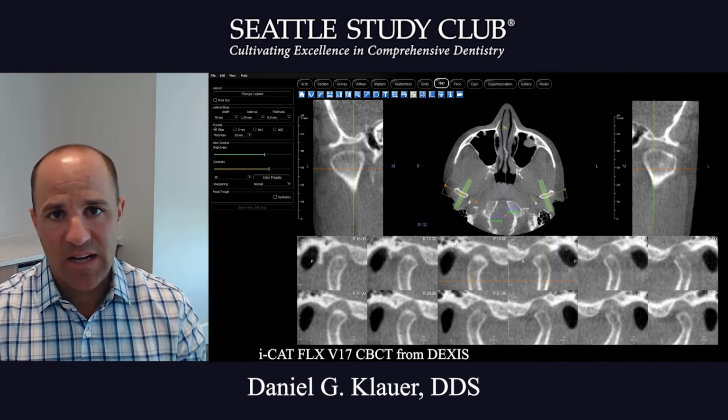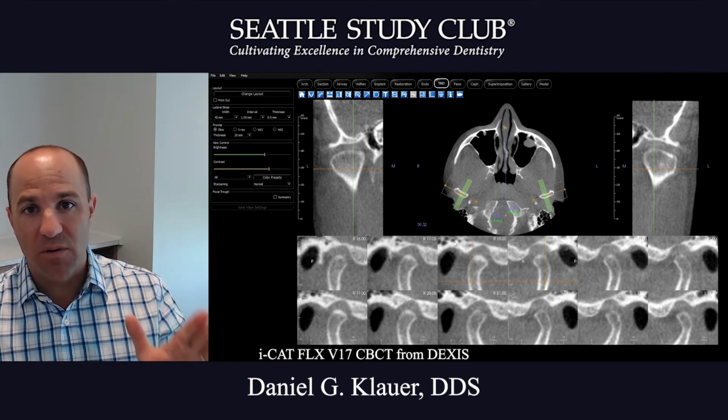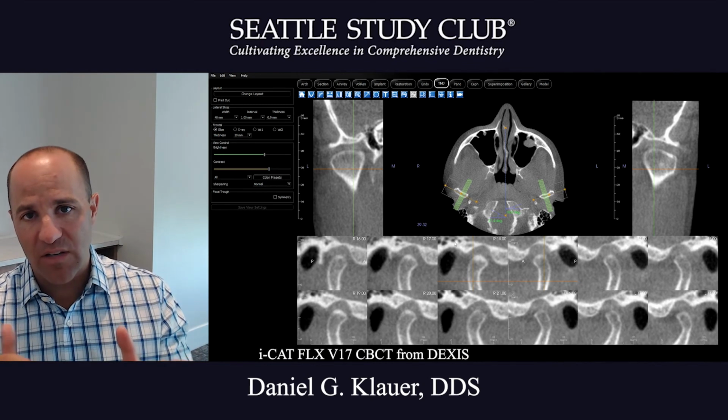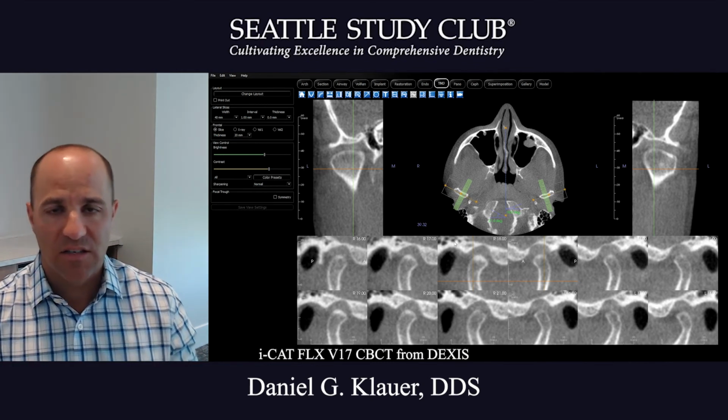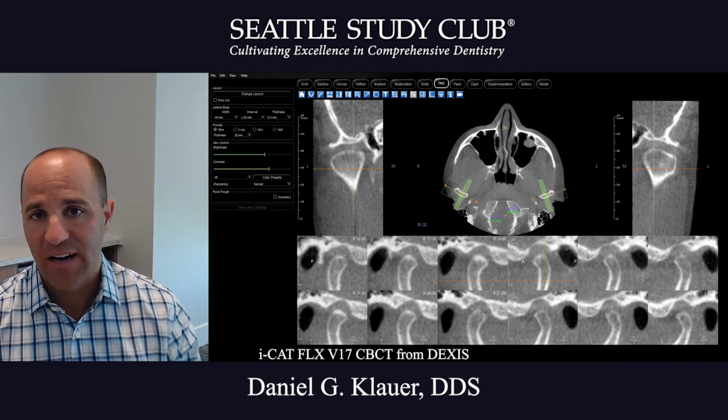So expert tip today would be go through the CT scan in a systematic approach so you don't miss anything. Have a document that you use to follow and mark those areas, and then work with a radiologist to compare notes, train yourself, and then have a resource to reach out to if you should need anything.